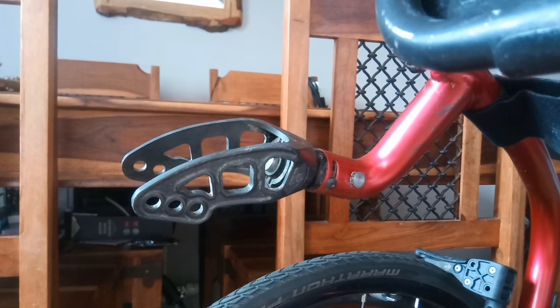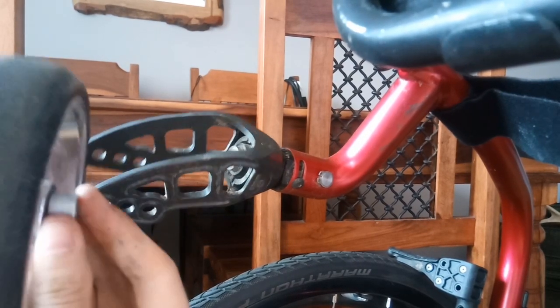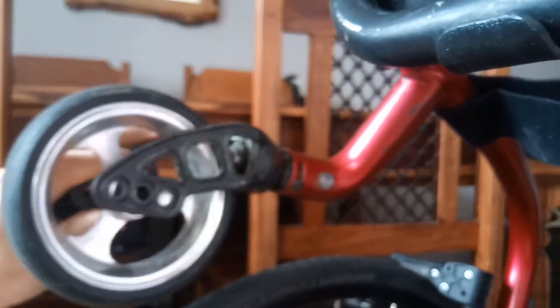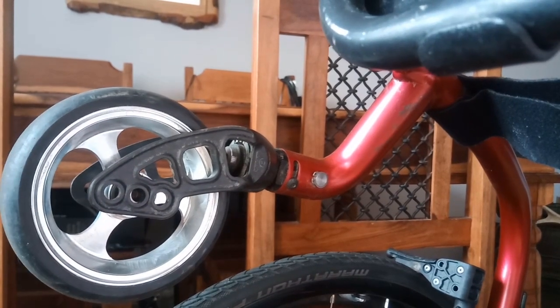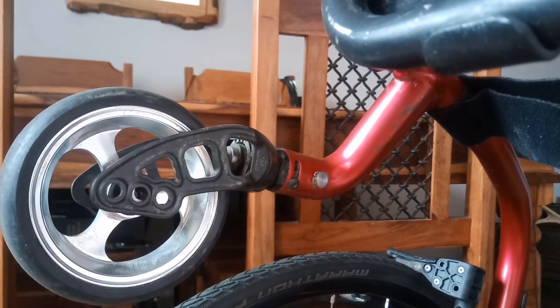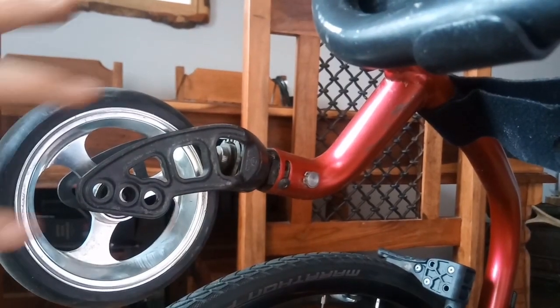So there's a couple of ways that you can do this. The way that I'm going to do it is basically just putting the two washers on the wheel, kind of lining them up already, and then just sliding them in. And now the wheels are quite tight, so if I can just get behind here, you can kind of make out the hole. So it's just a basic thing for when we start to put this in. So first I make sure that the first hole lines up, and then that lines up into the second one. And now I don't need to hold this at all, it won't fall out without damaging the bolt, in which case I've got other issues going on.